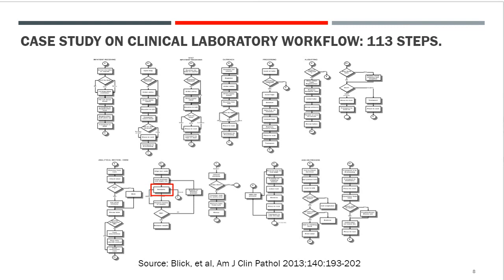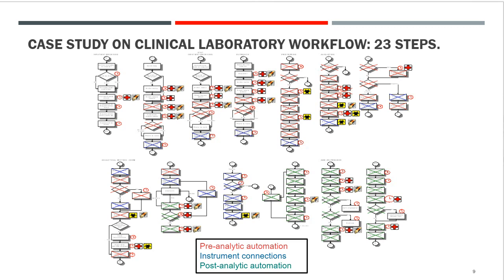The University of Oklahoma, by the time they finished, had their workflow down to 23 steps. And the advantage here is fewer steps is fewer opportunities for errors. Okay, they also eliminated, and you can see all the boxes that have been X'd out, and they've been marked. They could have been highlighted for a biological or infectious hazard to either patients or staff. They could have been possible wrong answer scenarios, and staff safety issues, repetitive motion injuries, things like that.